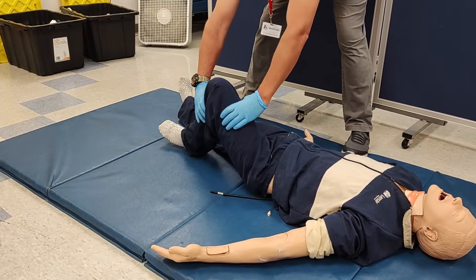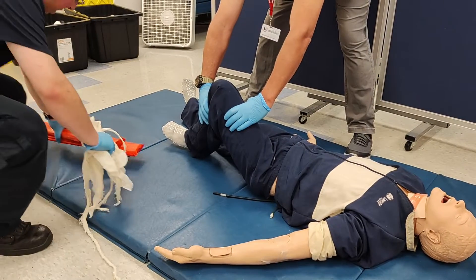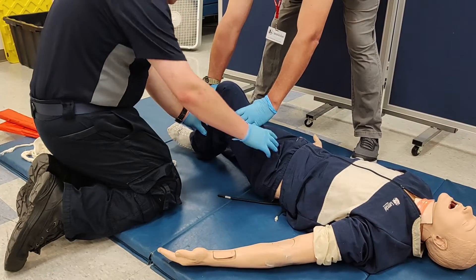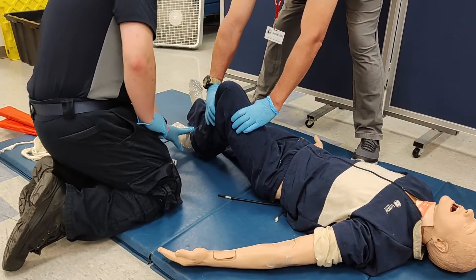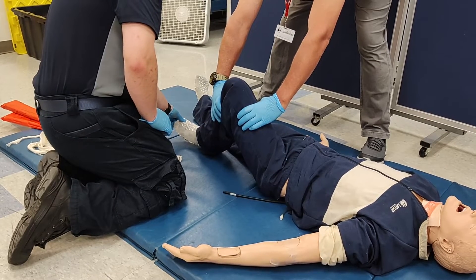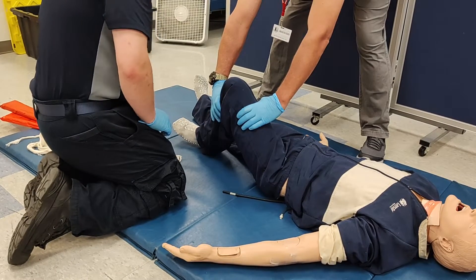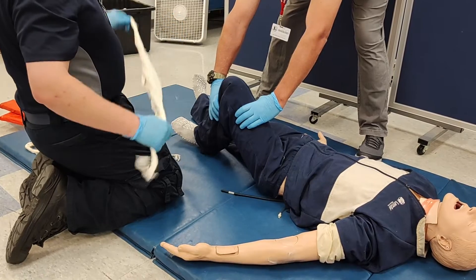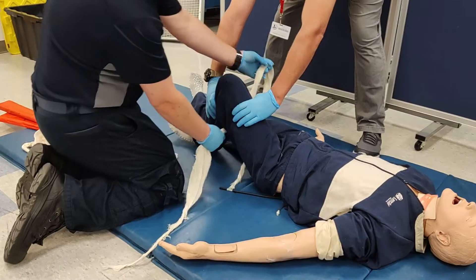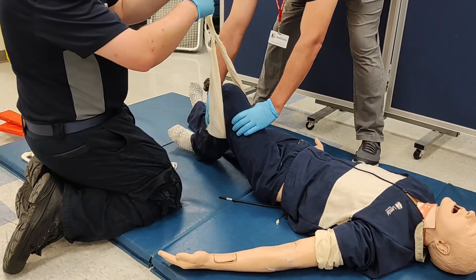EMT number one maintains manual stabilization of the limb, while EMT number two evaluates the limb and prepares his equipment. He checks the limb for any other injuries, assessing distal PMS. If distal PMS is not found, you may attempt one realignment. Assuming PMS is intact, EMT number two will begin the application of the splint.